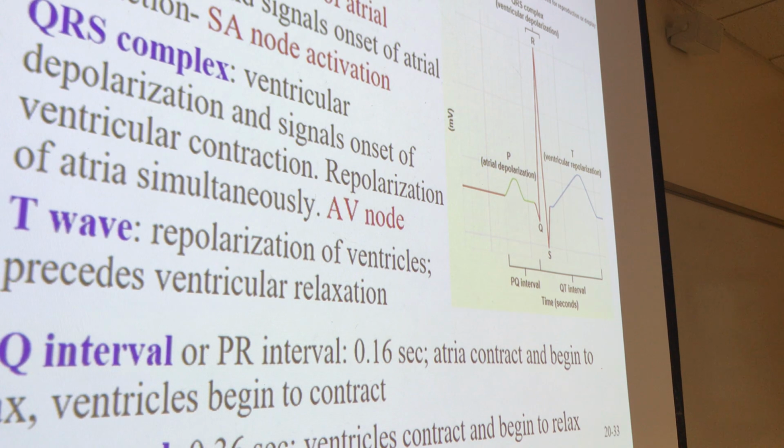What we want to see in a QRS complex is a very narrow, very peaked QRS. Peaked meaning that it goes up high. We know that when we stimulate it, you're able to contract almost immediately, which is good. If there is a lengthening, then we know there might be an issue, which can be a pathology.